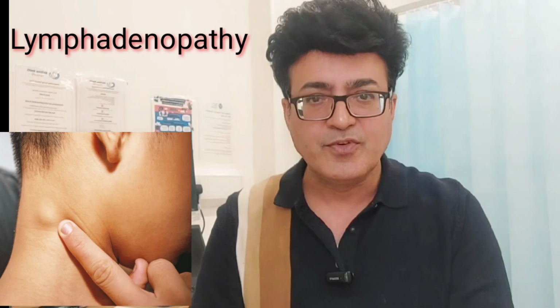If you detect an enlarged lymph node and label it as such, mind that you know the criteria. You have to look for anterior posterior diameter enlargement regardless of the transverse diameter. So pay attention to the anterior posterior diameter. If it is enlarged, and you have confirmed that the outline is smooth, there is a preserved fatty hilum and there is no internal necrosis, these 4-5 points are the criteria for labeling an enlarged lymph node.